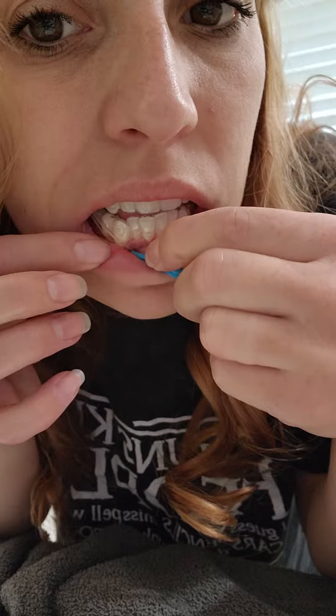I have three rubber bands that I have to put on — this one, this one, this one. There's a hook on the Invisalign itself instead of a button, so that's always nice. And this one is a little baby rubber band right there, in between those two teeth.